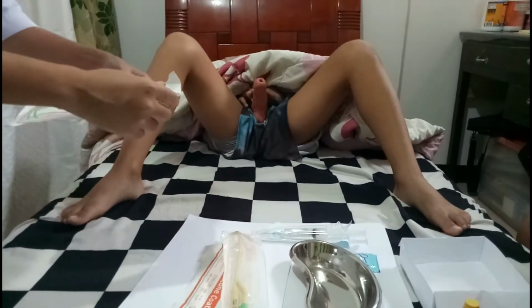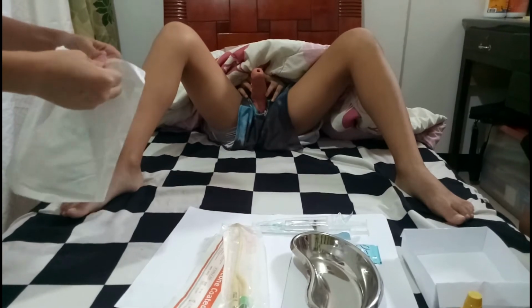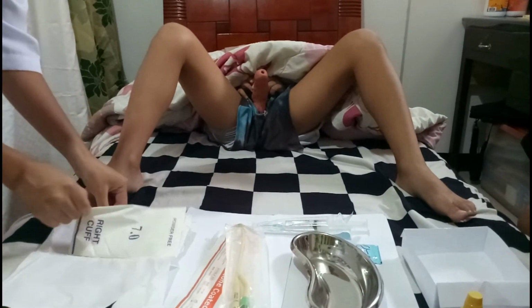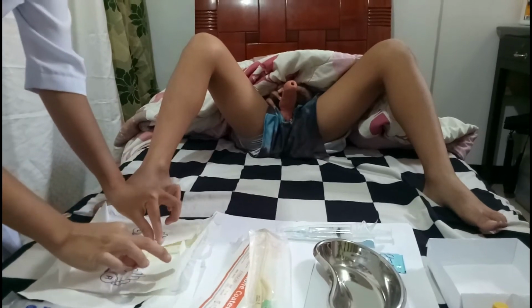So, sir, I'm just going to prepare the equipment. Now, I'm going to open the surgical gloves and wear the sterile gloves. I'm just going to touch the side of each glove to maintain the sterility of the gloves.